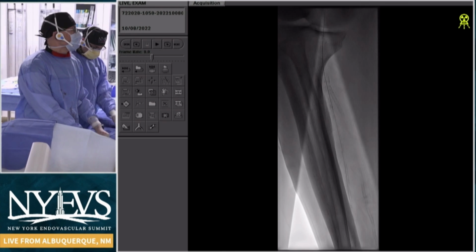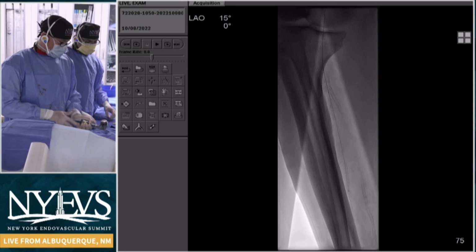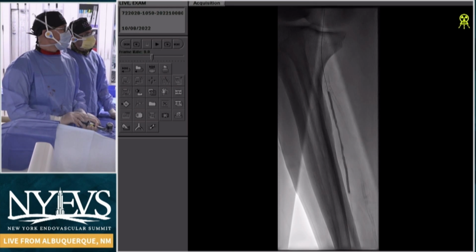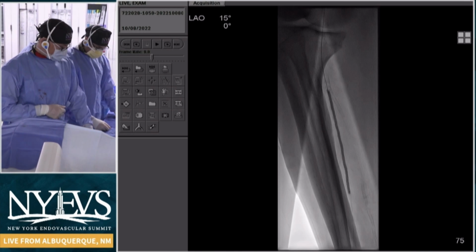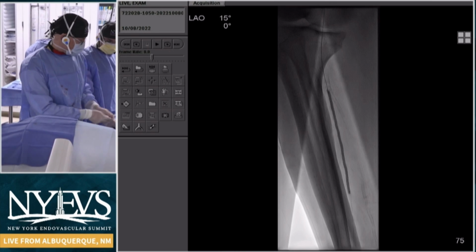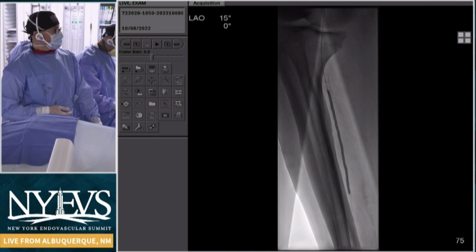Sahil? Well, I think Steve's demonstration with the DVA was proof positive of that approach. The TcPO2 continued to rise over several months, and it was a relatively long ramp up. Yep. And with that torrential amount of flow, even with that much flow in these small vessel disease patients, it takes time. So I think perfect is the enemy of good enough. If we stick to that adage, we'd probably be better off. Errors of omission are sometimes okay in this population.